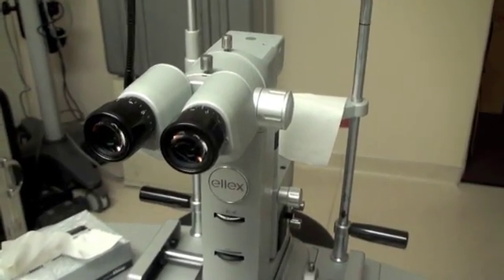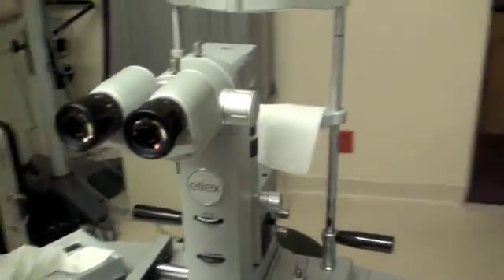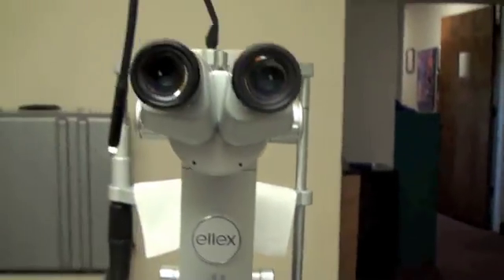Today we're going to discuss a little bit about the YAG machine and how to sit at the YAG machine. First, I'm going to show you the perspective from the surgeon's end.